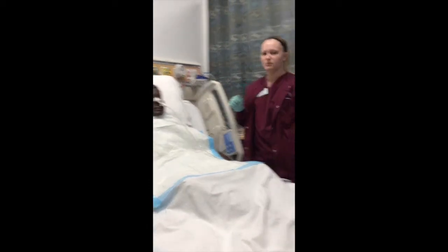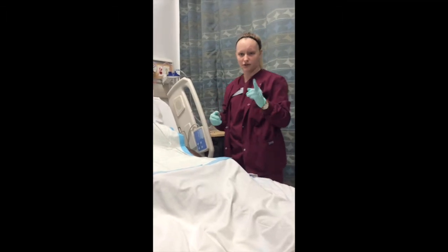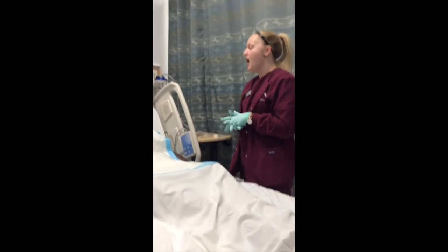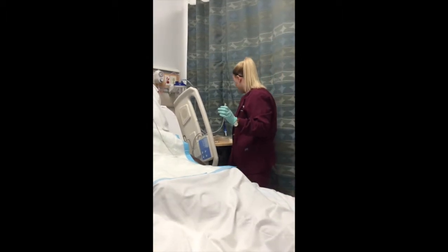Something that I would have wanted to do before I inserted this, I would have wanted to wash their nose off, get all that oil, any secretions off, so that's something good to remember. So now that I've got it inserted, I'm going to go ahead and get my tube ready.